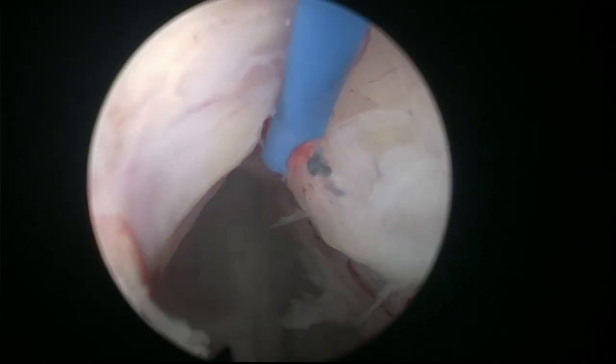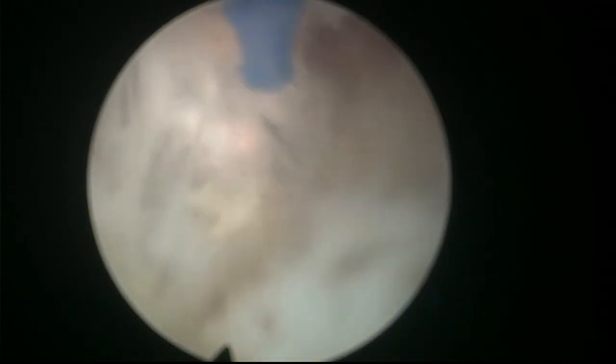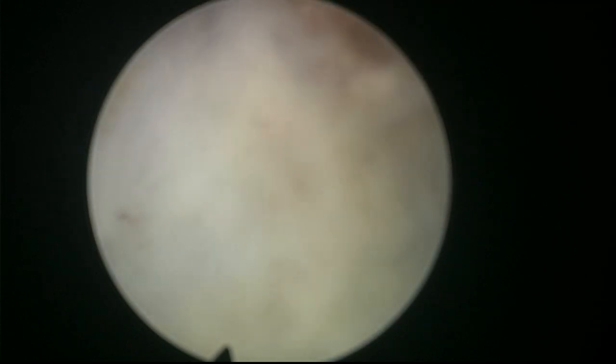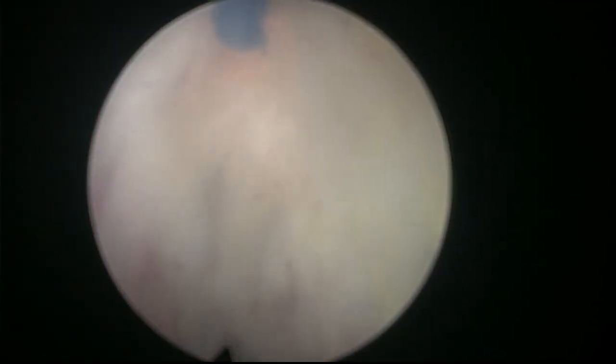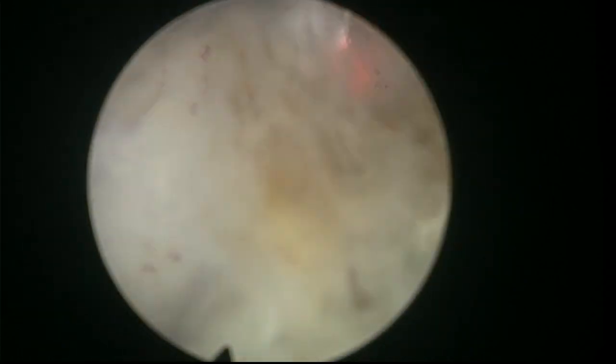So here you see we are under the sphincter, and this is a nodule, so I'm going to cut initially here to separate. I keep horizontal. You see this is fibers at 12 o'clock, and as we enter in a deeper layer, then it's easier to follow the plane, and it's also safer for the sphincter, which is what we want to preserve at all costs.